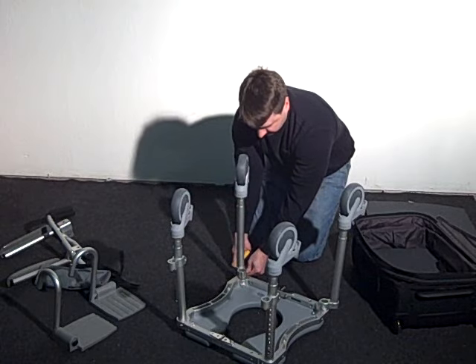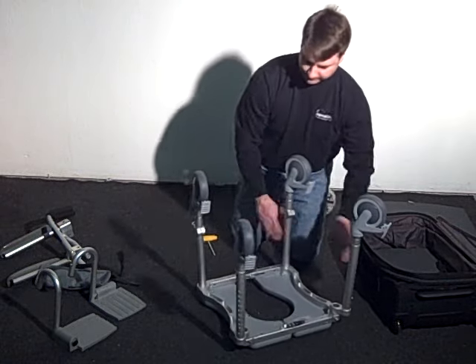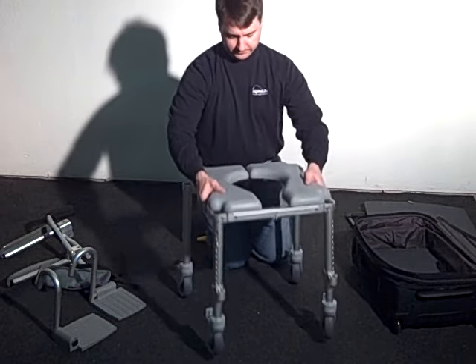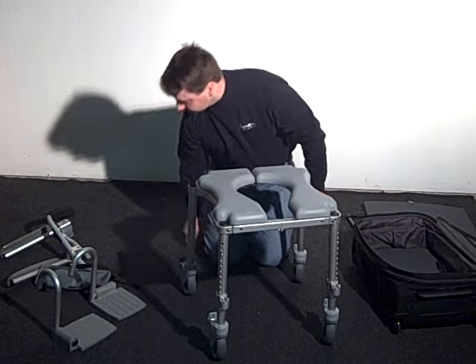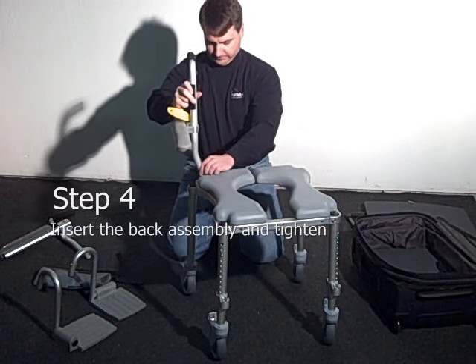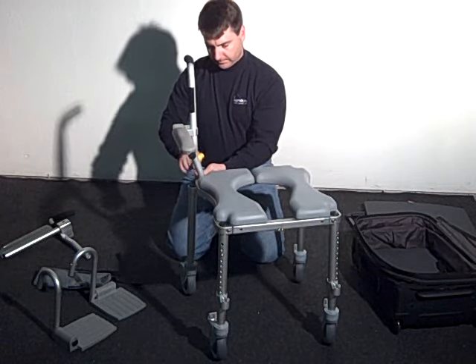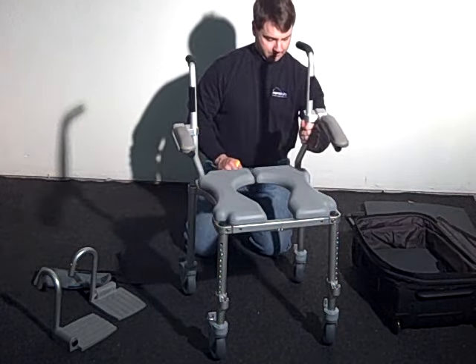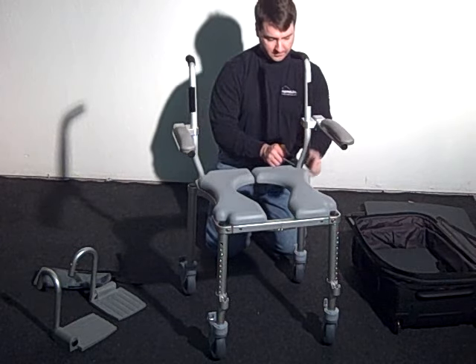After all forelegs are installed, turn the chair right side up and install the back post and arms. There is a right and a left post. Slide the back post into the rear holes on the upper seat frame. Each of the posts has an internal clamp that tightens the post in place. Prior to tightening, make sure that the saddles with small anti-rotational semi-circles drop into the corresponding feature on the frame.